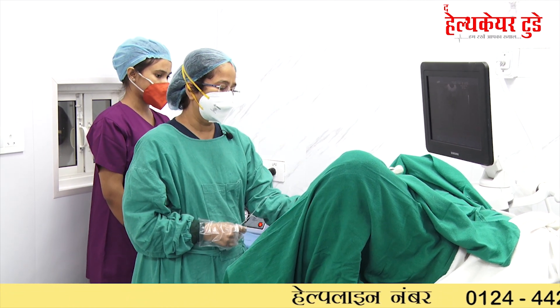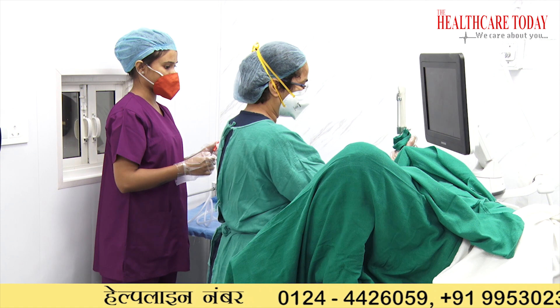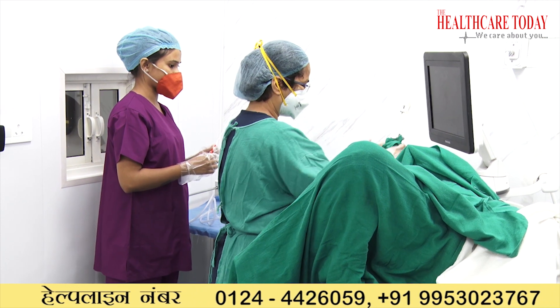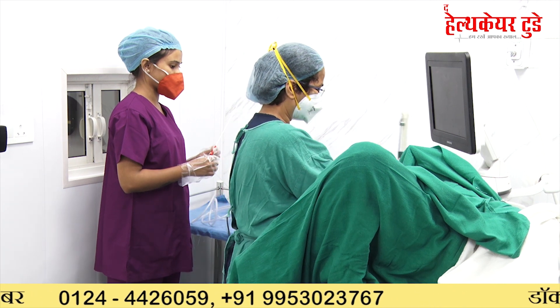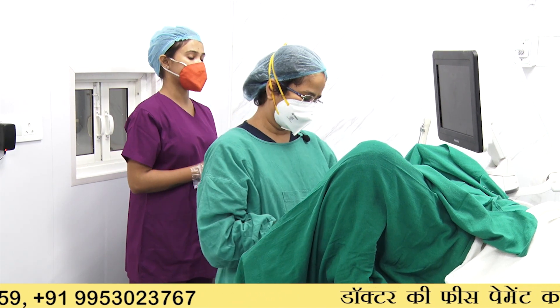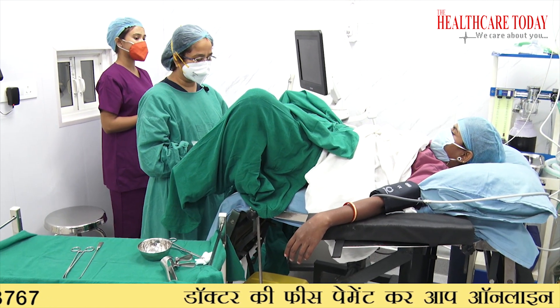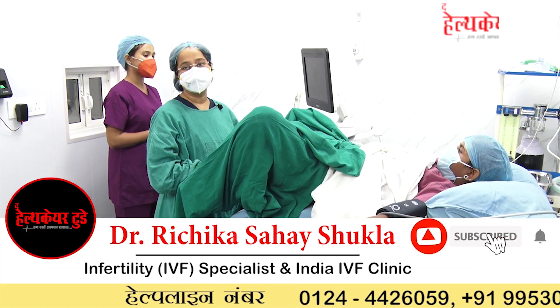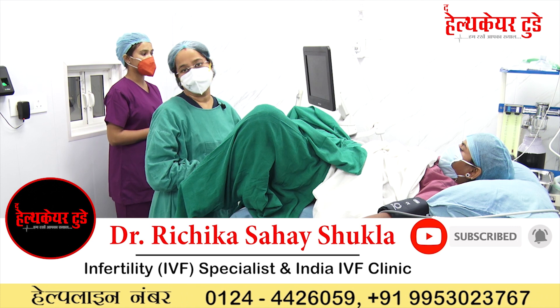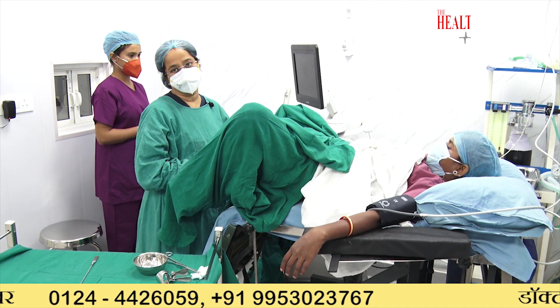After fluid aspiration is done, always clean the vagina and check for bleeding. If there is more bleeding or any problem, put the speculum inside with the valsalum and check the bleeding site. If there is any bleeding site, never shift the patient to the post-op ward — you must first stop the bleeding and then only shift the patient.